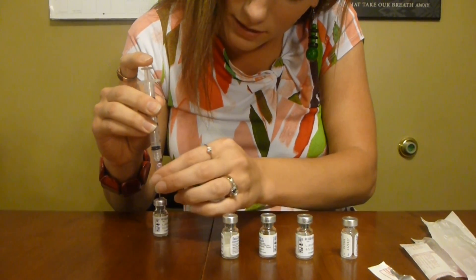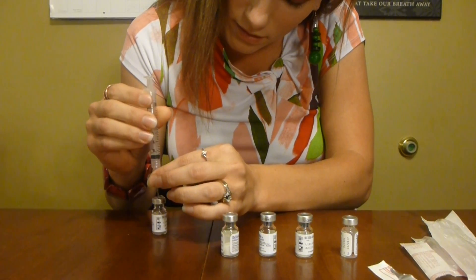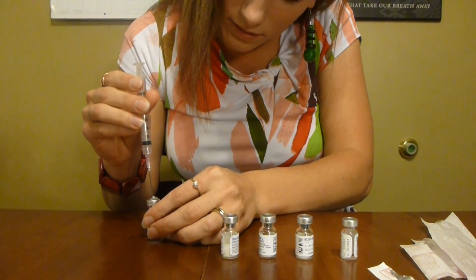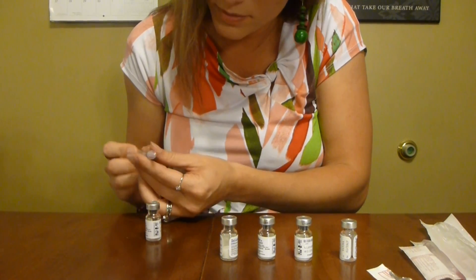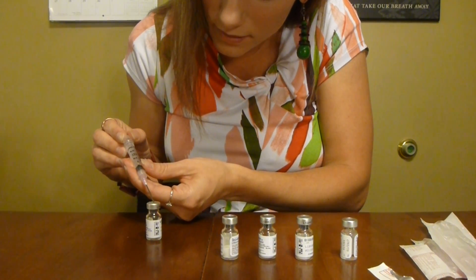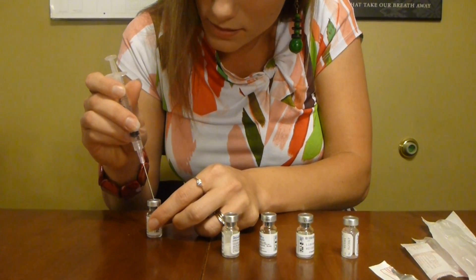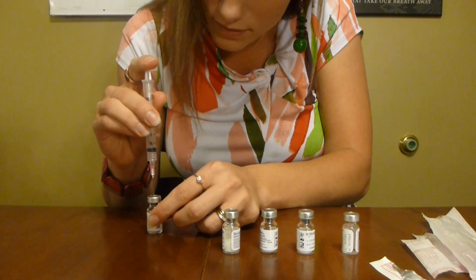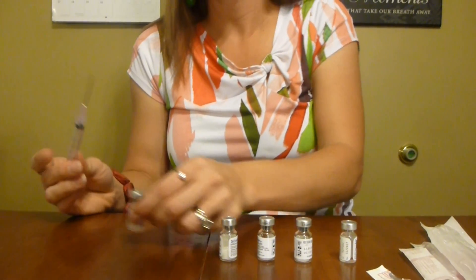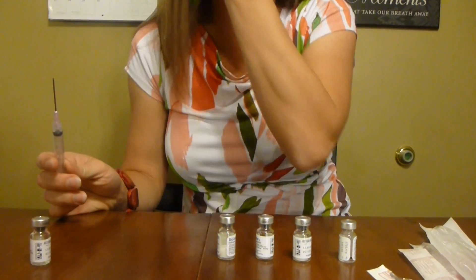That was kind of interesting — it's not on there very good. A little bit spilled out there, so I'm going to suck that up and put it back in because that's expensive stuff. We're all good. I'm going to put that aside — I'm done with that for now.